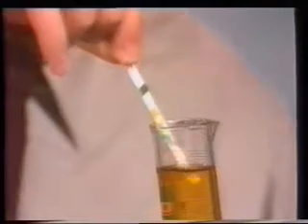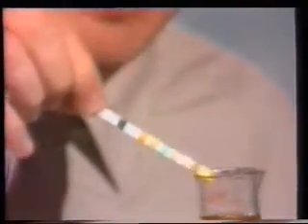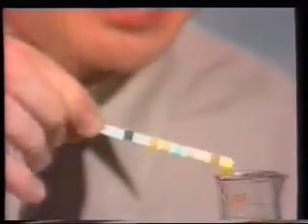And as you pull it out, wipe the excess urine off the strip onto the rim of the vessel like that. Then hold the strip horizontally. Hold it horizontally for 2 reasons. Firstly, to stop all the colours merging with each other, and secondly, to stop the urine flowing backwards along your fingers and up your arm.